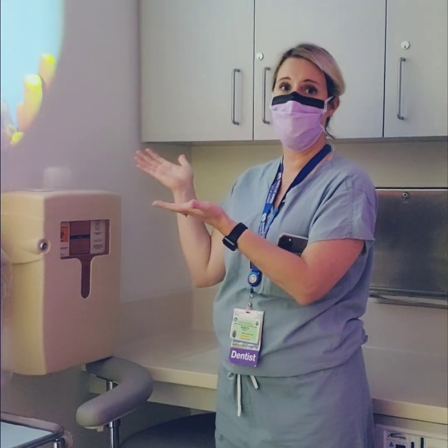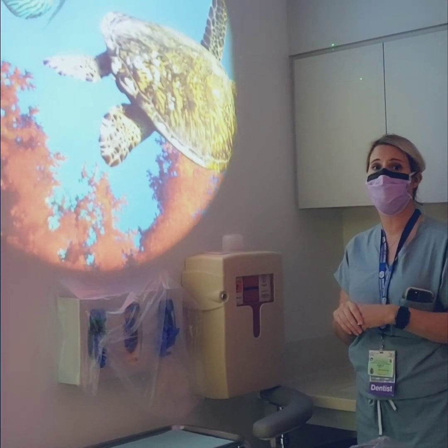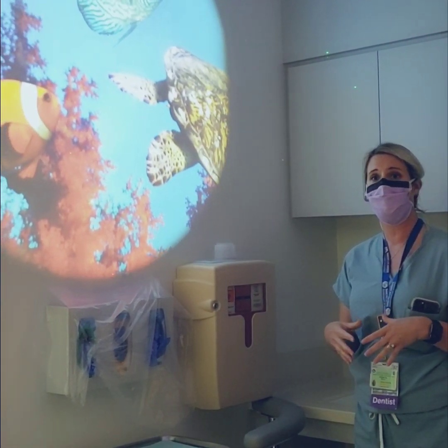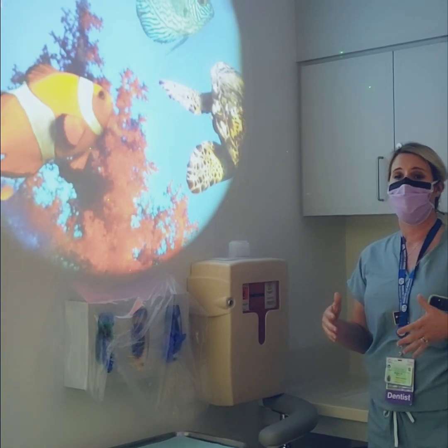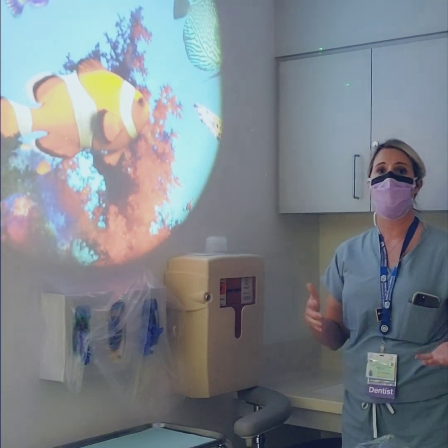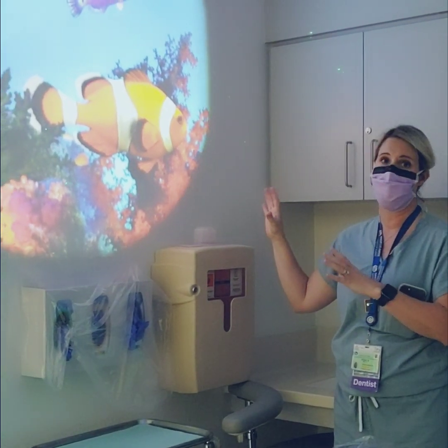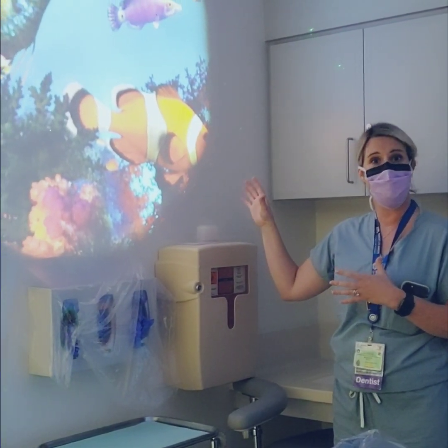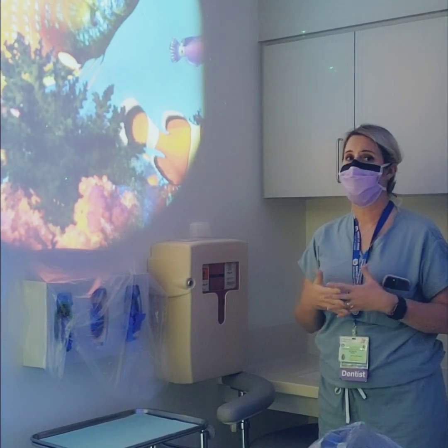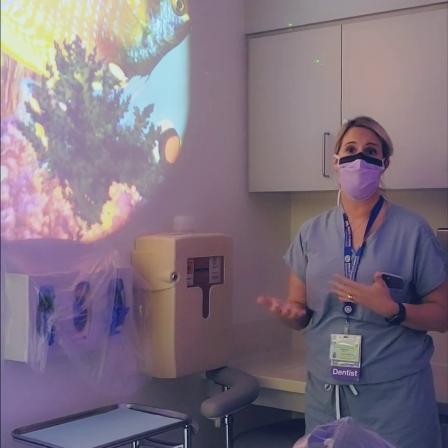So this is the picture produced by our solar projector. This piece of equipment was actually one of the first pieces of equipment used in the studies to define the sensory adaptive dental environment. So it was really breakthrough studies that first introduced this concept of combining sensory calming therapy along with dental treatment. So basically the solar projector has a variety of different discs. This particular one we chose was a fish, kind of an aquarium scene, but there's stars, there's planets, there's all sorts of other options. So we can tailor it to whatever the child or the patient would like.